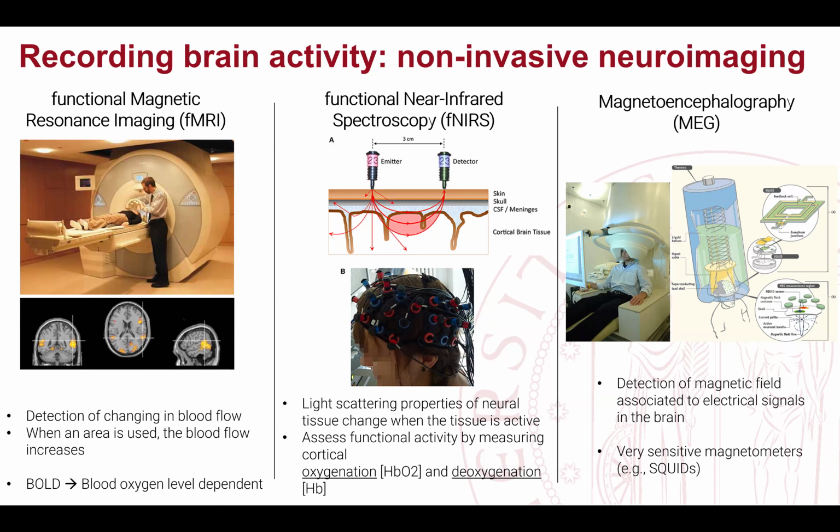And so to have a similar imaging as the one that you would have with an fMRI, of course with lower resolution, lower precision, but now it's portable. So this can also be wireless, so it can be used daily, it doesn't require any means, you can just put it on and use it. So it is a very interesting technology for cognitive neuroscience in the real world.